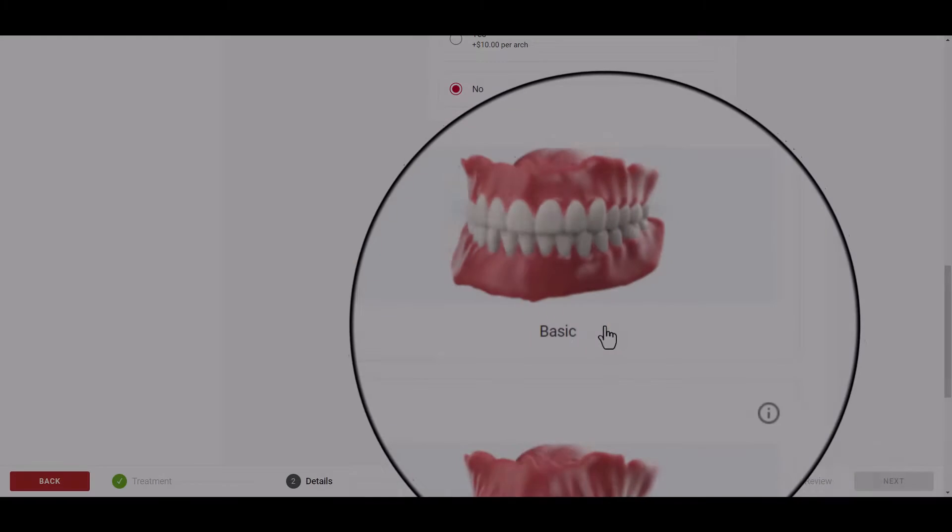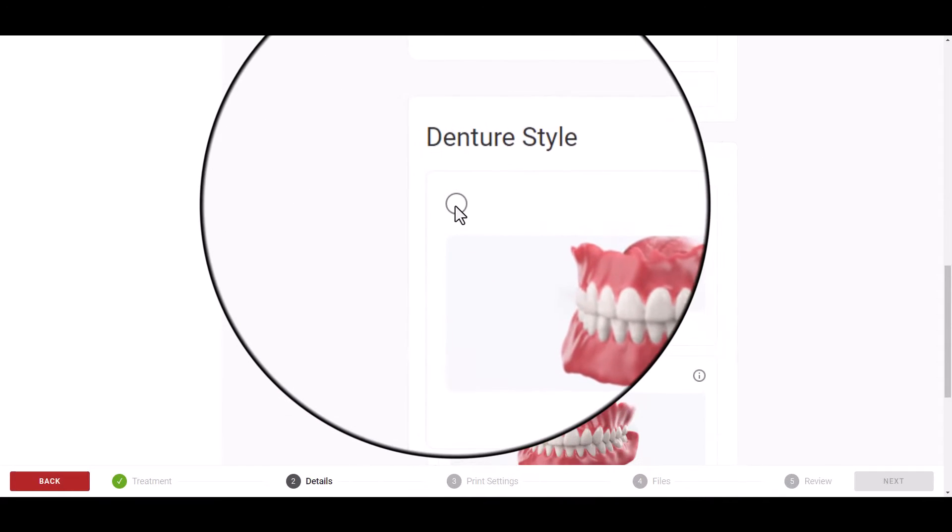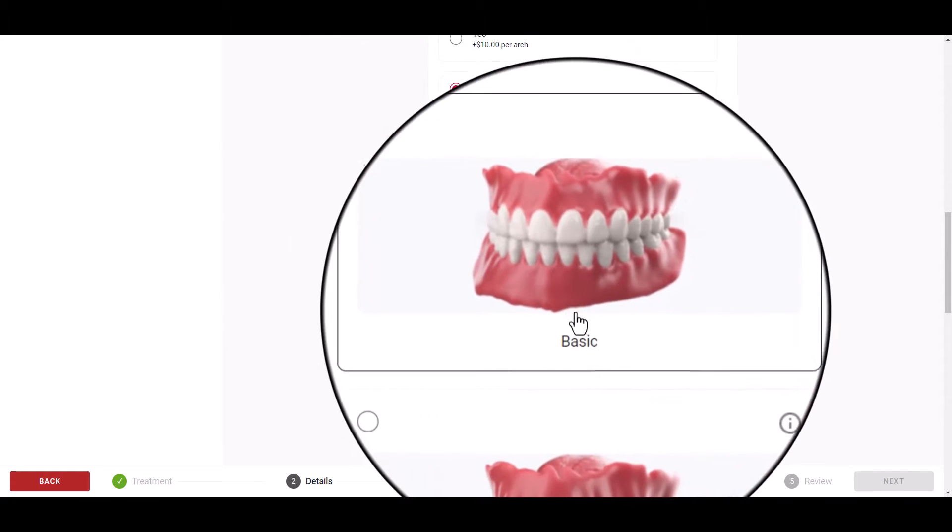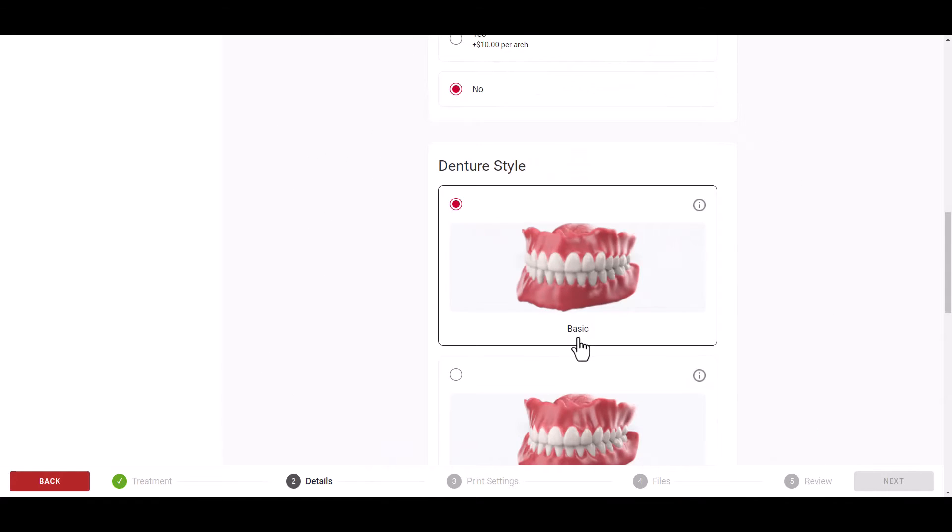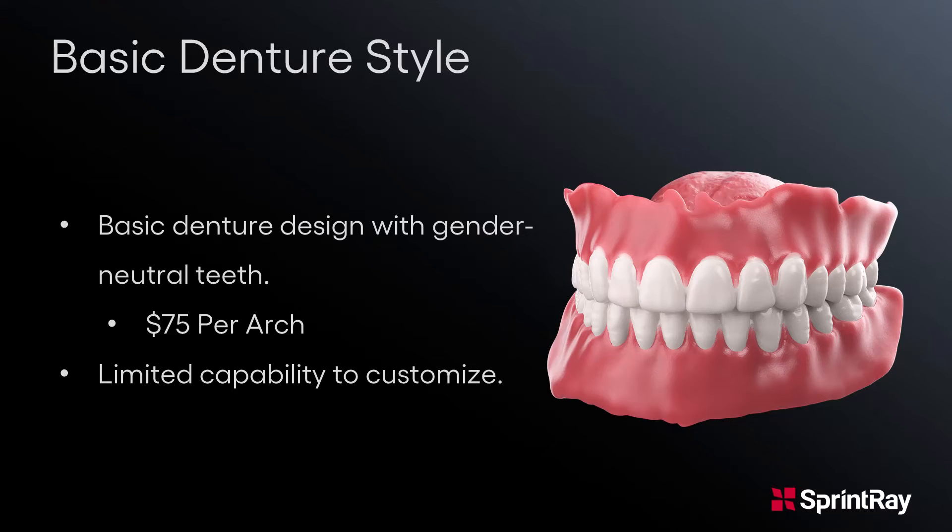Basic Denture. Under the Denture Style section, click on the Basic Denture. The Basic Denture has gender neutral teeth and limited ability to customize and starts at $75 per arch.